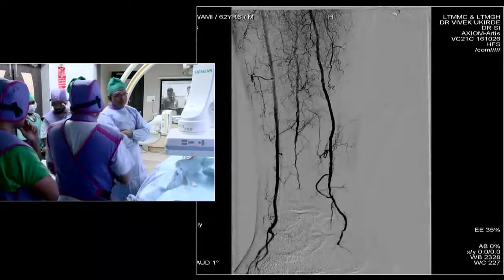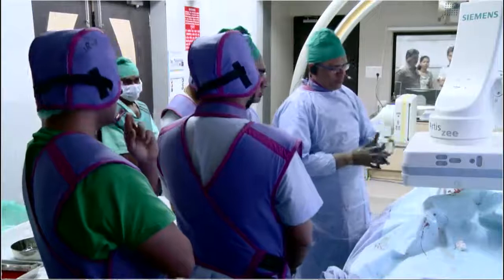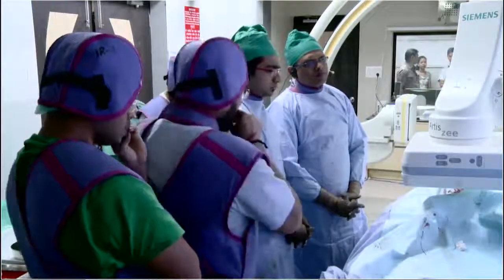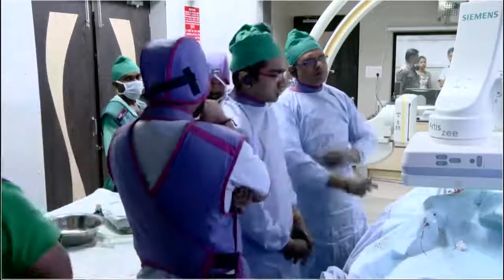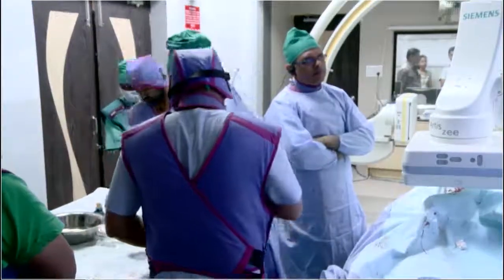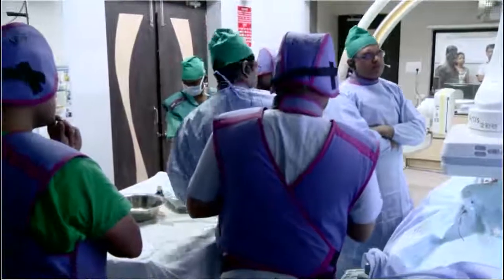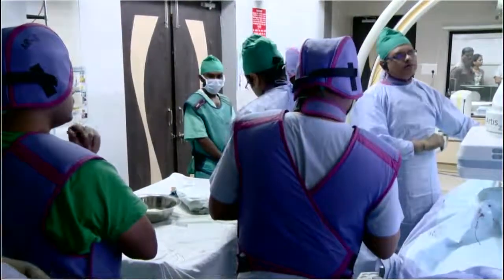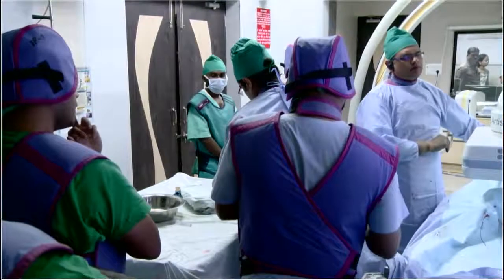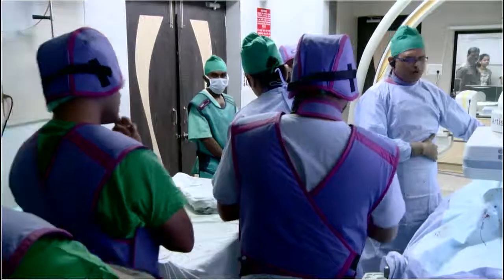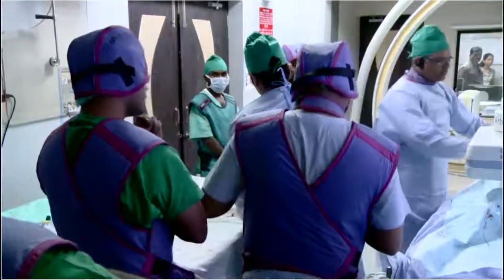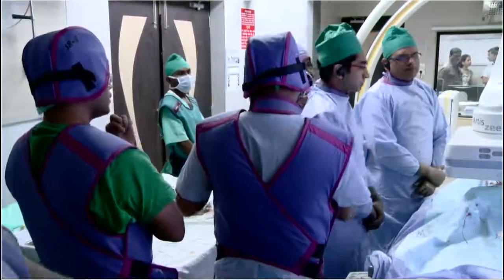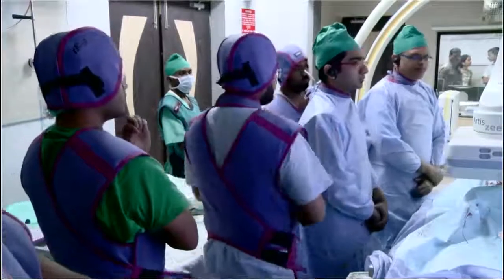Vivek, I think we will give you a chance to decide what further you want to do with this patient, but you demonstrated very well how tibial arteries are to be handled. It is definitely a different challenge compared to the SFA and iliacs. Multi-vessel, long-segment, calcified lesions are always a challenge. Thank you very much, Vivek and the team, for a great demonstration — we really loved it and learned something from what you did today.